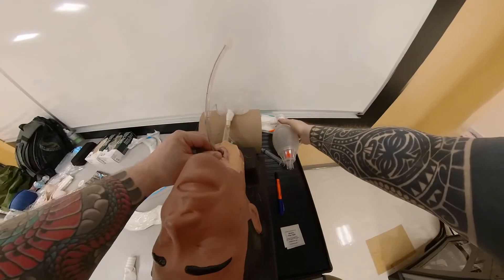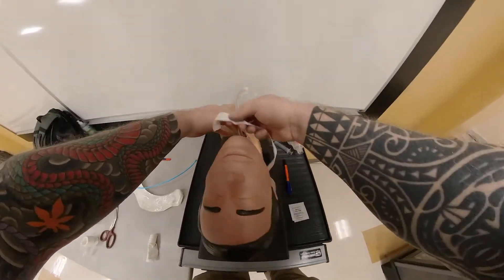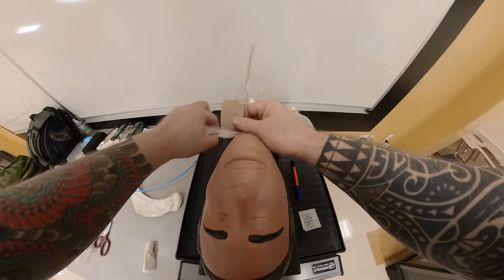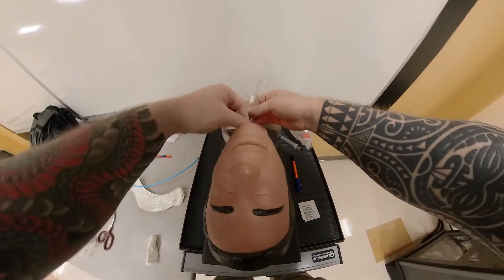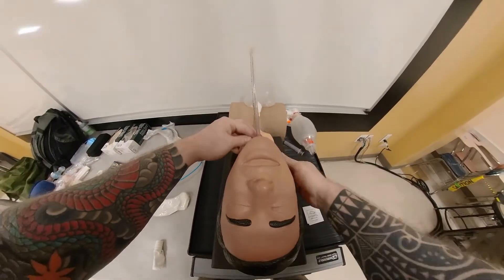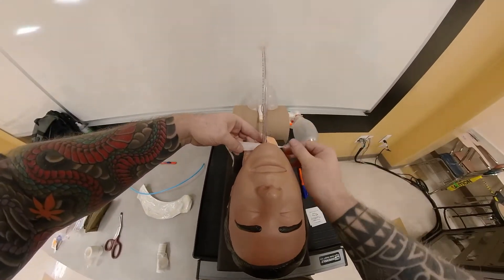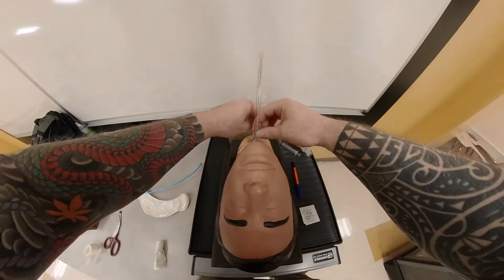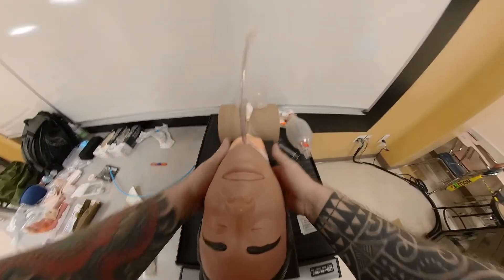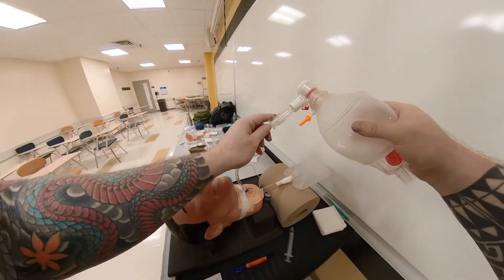Pass the BVM off to your partner to squeeze. Here I already have some tape — this is a very easy way to secure it. Put a bridge of tape down, wrap it around the tube one way, then the other way, and one more wrap going the opposite direction. Put another bridge. Go around the tube. Once this is secured, reconfirm your lung sounds and your end-tidal CO2.